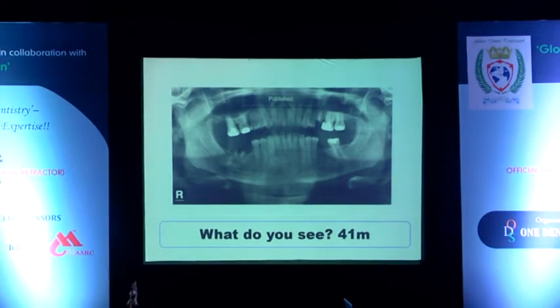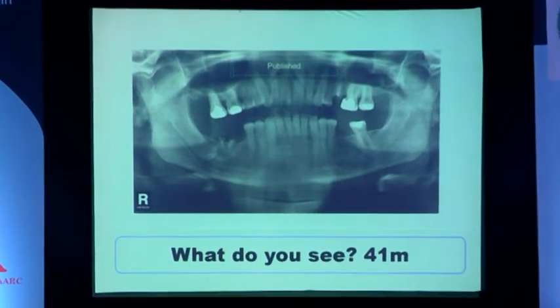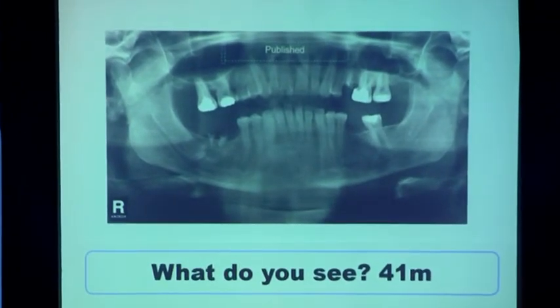Okay, this was one of my patients, 41-year-old. This was recently published in the month of February, and this was an incidental discovery. What is the variance you see in this patient? The sinus is normal. The variation in this patient was that the patient has coronoid foramina bilaterally. He has a foramen here and a foramen here on the coronoid aspect, and he has a big foramen on the lateral aspect of the body of the mandible.